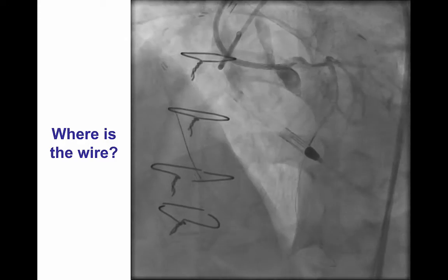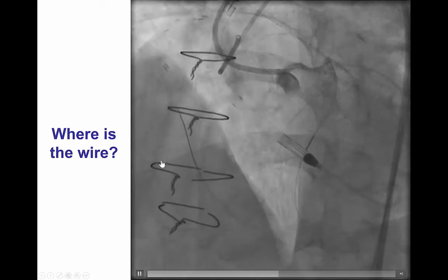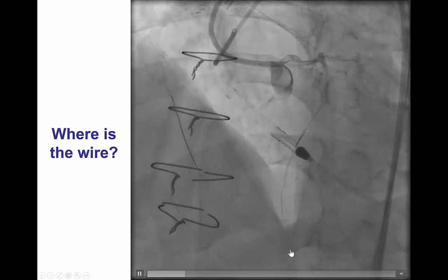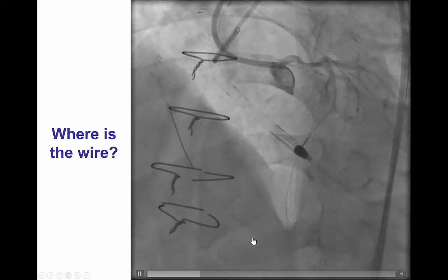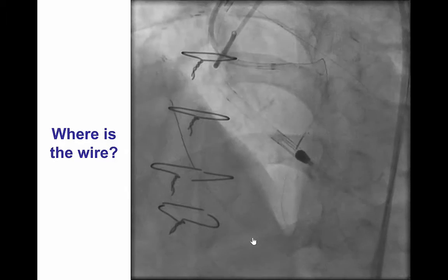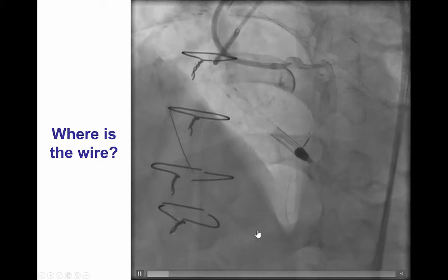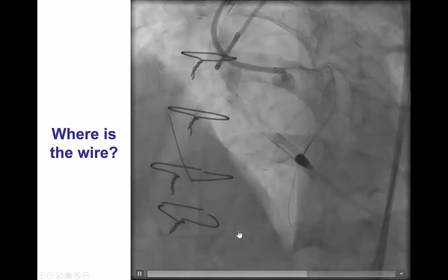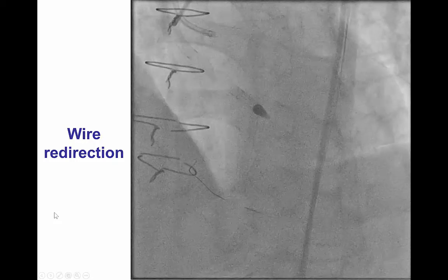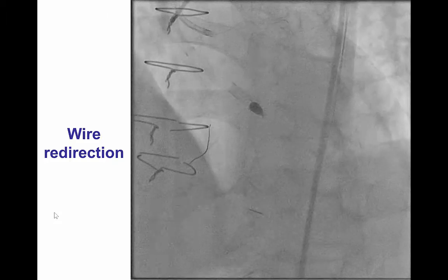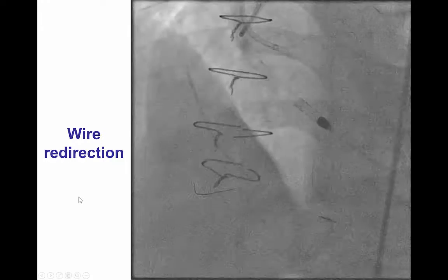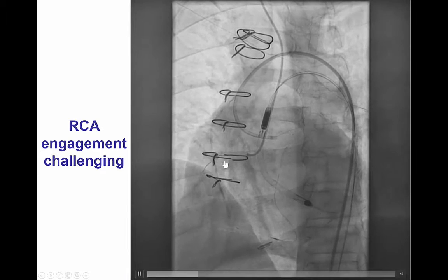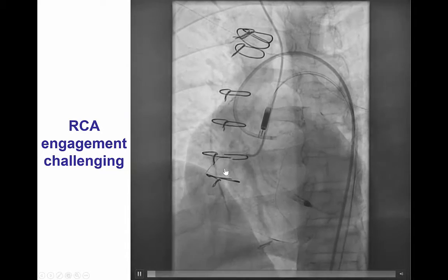However, the wire then took a different course instead of going into the distal right coronary artery — it was advancing in an entirely different location. This was actually the occluded saphenous vein graft to the posterior descending artery, which might have been the culprit for the recent non-ST elevation myocardial infarction. This is a very common challenge when trying to wire through vessels with bypass stumps — the wire may follow the course of the bypass instead of going into the native coronary artery. We were able to redirect the wire from the saphenous vein graft back into the distal right coronary artery, and then advance it all the way to the proximal RCA. It appeared that the occlusion was fairly short between the ostium of the right coronary and the distal cap.